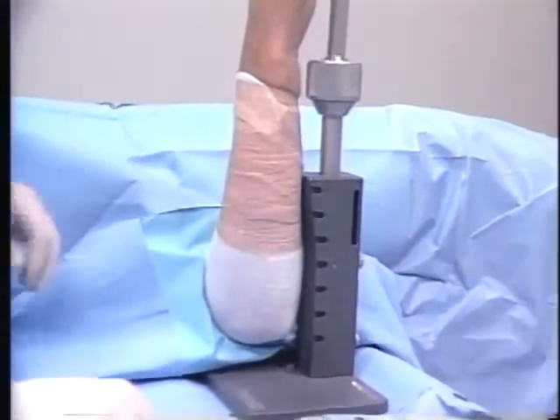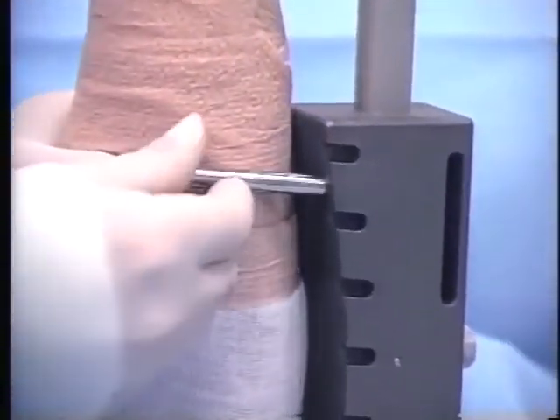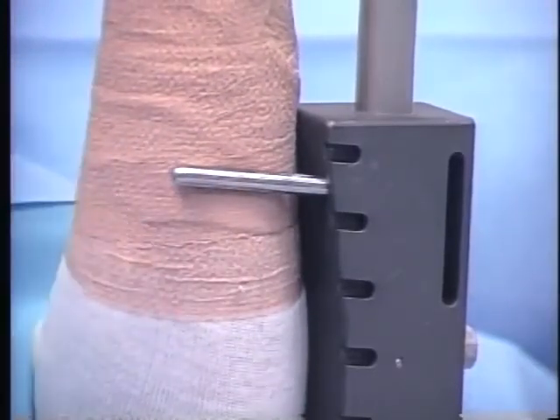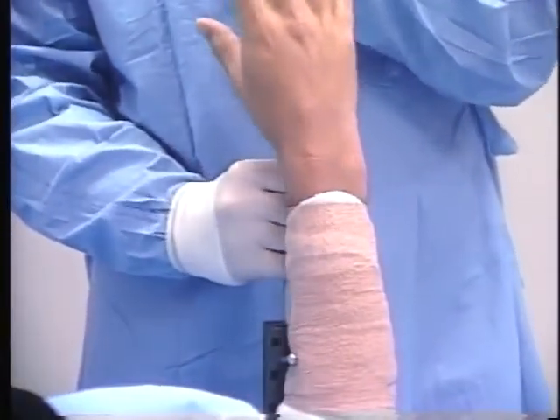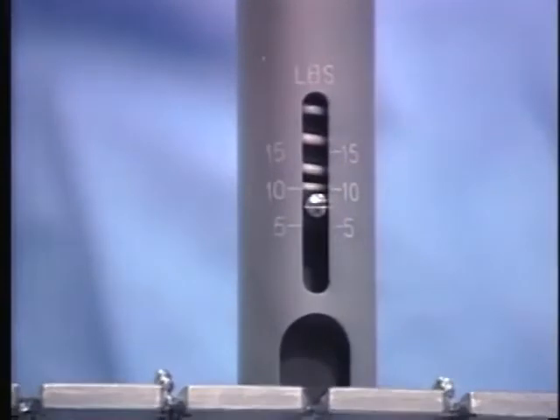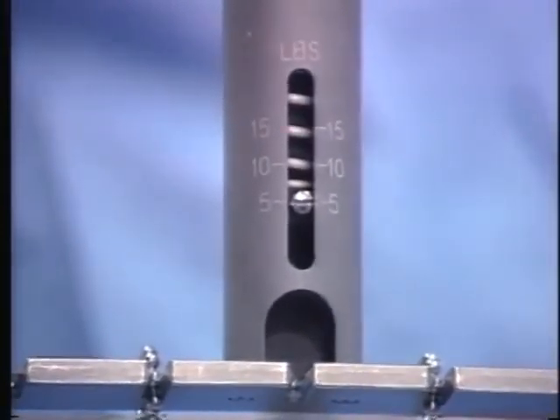To facilitate radial or ulnar deviation, the radial ulnar deviation pin can be placed in the appropriate cavity of the primary support to counteract the pivotal forces. It is important to note that moving the upper portion of the traction tower to alter wrist flexion, extension, or radial ulnar deviation will affect the traction force being applied.